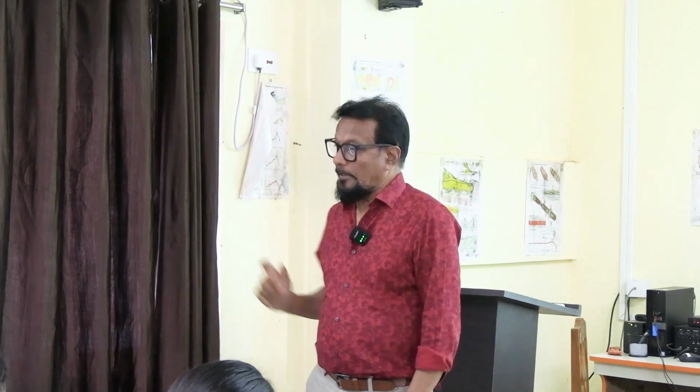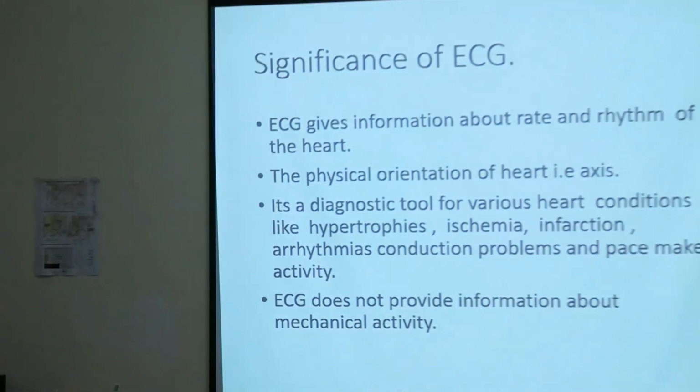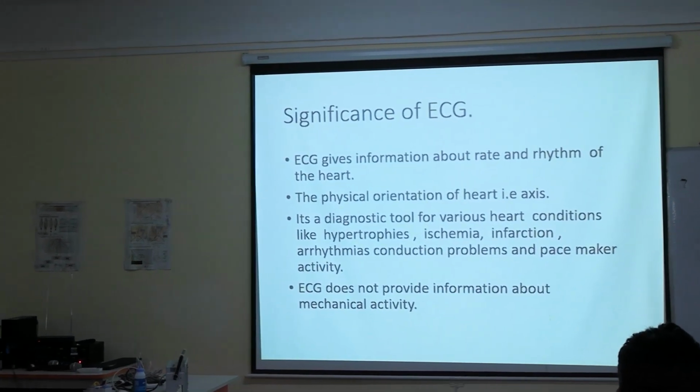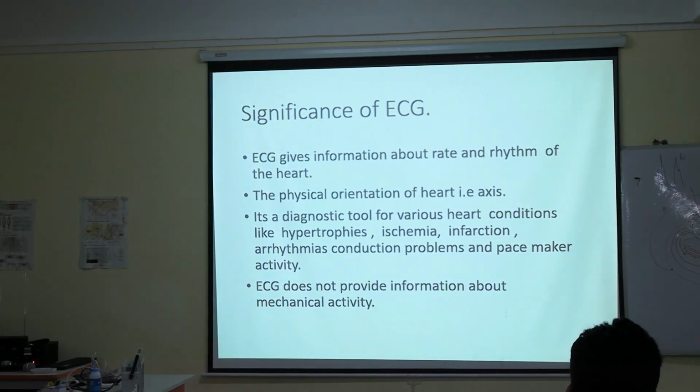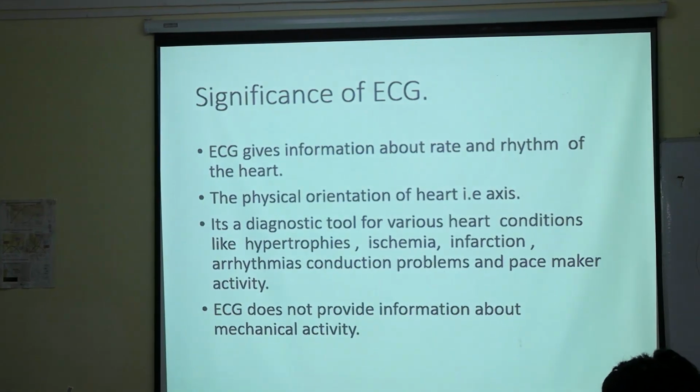What is the significance of this method? Why do we perform electrocardiography? Definitely it will give some information. What information does it provide? It gives the heart rate, the heartbeat.